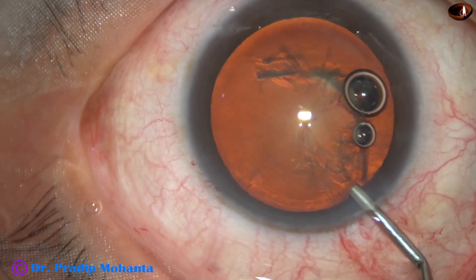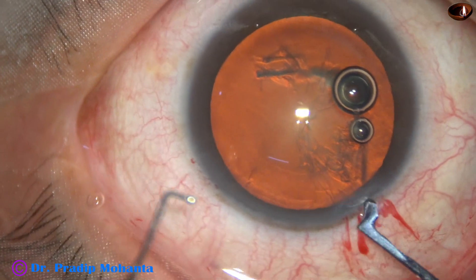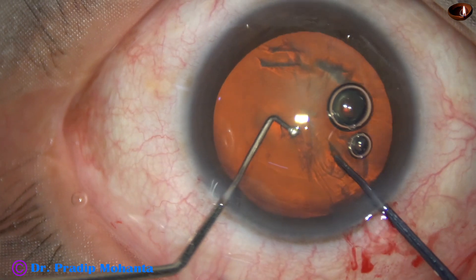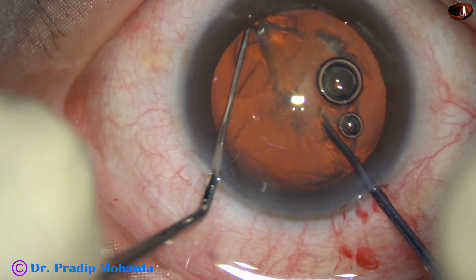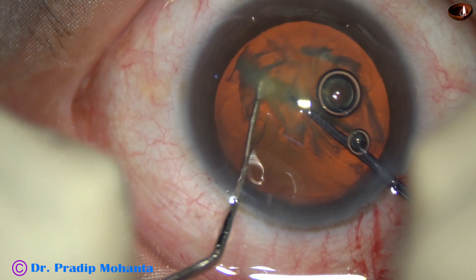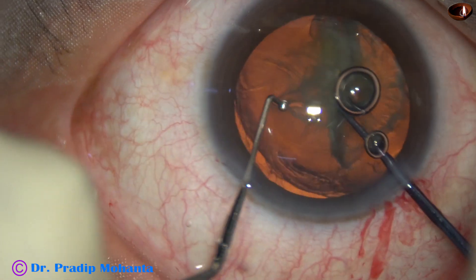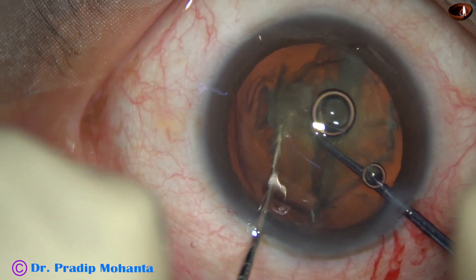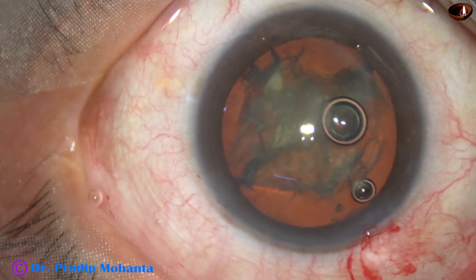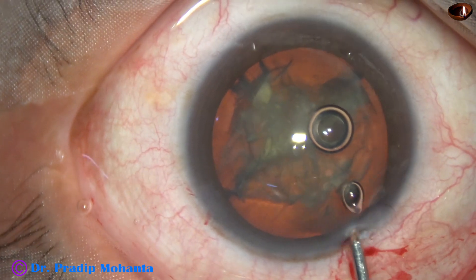Some more visco, and now watch the use of this pre-chopper. This is designed by Dr. Swahil Irfan Khan of Nanded, Maharashtra. The nucleus can be easily divided into two halves, and then I divided one hemi-nucleus into two pieces. I didn't divide the other hemi-nucleus.